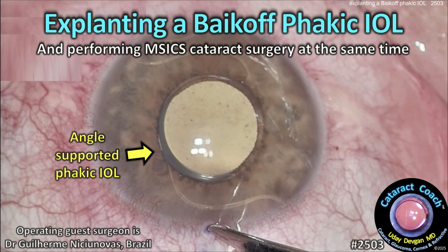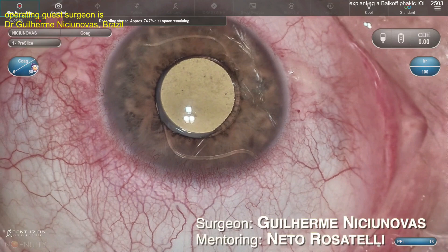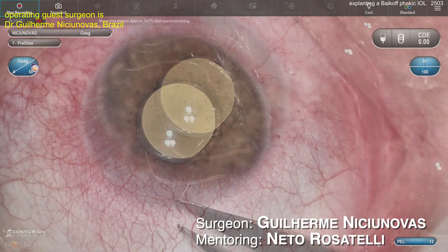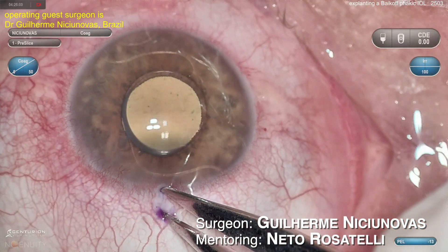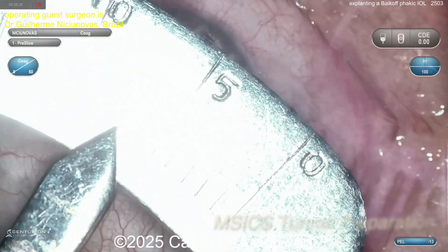CataractCoach.com — explanting a Baikoff Phakic IOL and performing MSICS cataract surgery at the same time. This is an angle-supported IOL meant to treat high myopia. You can see those arms there, mounted and supported in the angle. This patient was highly myopic, probably minus 12, 15 or more.